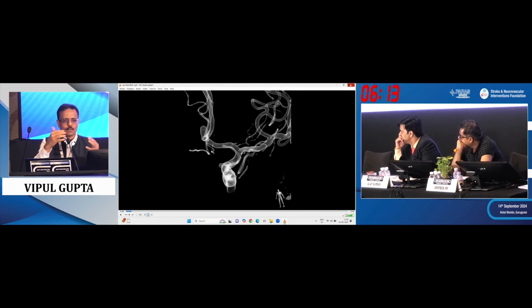And in our mind we do it. I know some Japanese groups said they can create 3D models that predict which shape to use, but we work it out in our mind, all right? So we know an ACOM superiorly pointing aneurysm will usually need a reverse shape. Inferiorly pointing is usually a J. And for an eccentric pointing lobule, we give a perpendicular shape.